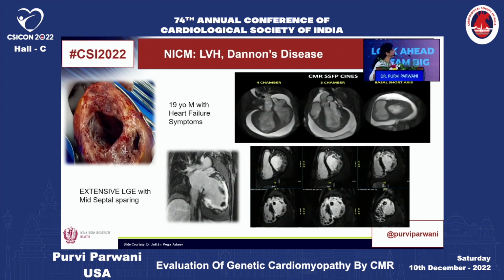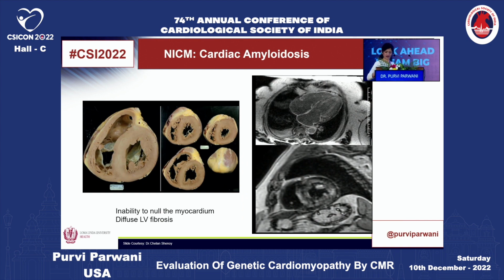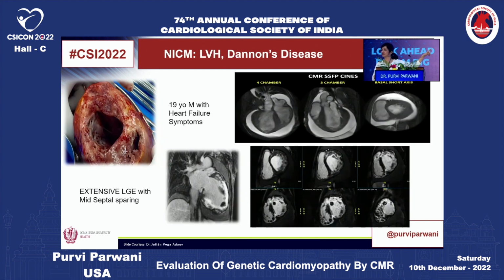This is a case I borrowed from a colleague. Can you play the video? These are really good images.